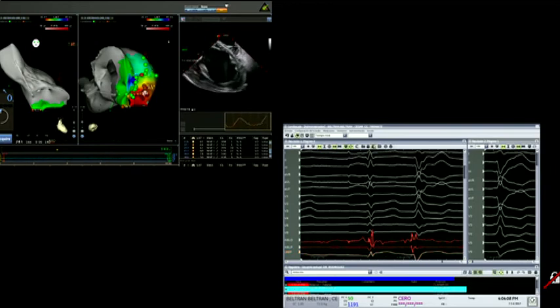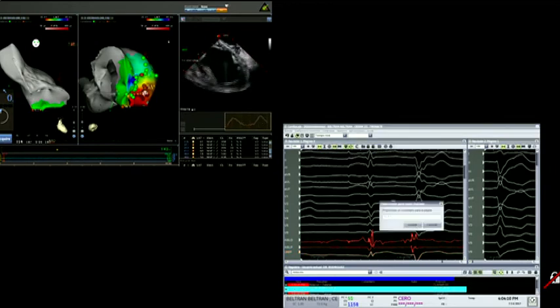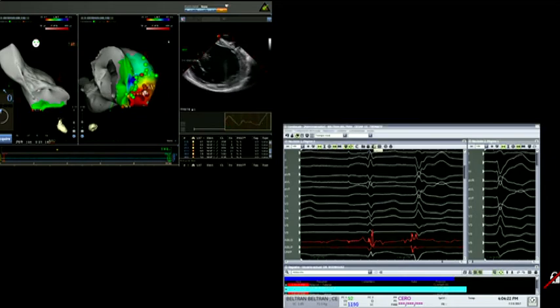We are discussing with Miguel that it seems to be a very high dosage, but we are going to use that just for 10 minutes. So, 40 microgramos por kilo por minuto. Andrea, is it given for 40? I don't know. En eco se pone hasta 20. 40, ¿no? No, yo 40. Yo recuerdo llegar hasta 20, ¿no?